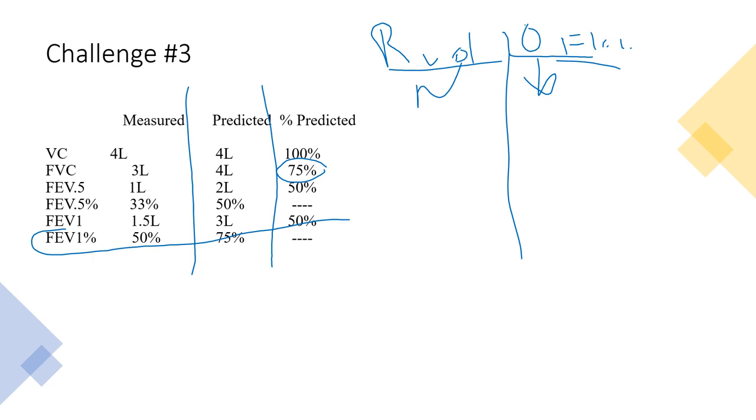And a normal volume. Oh, wait a second, Derek. What about my forced vital capacity? Wasn't that low, because normal is 80 to 120% of predicted? Yeah, that's low as well. However, just like we were talking about before, with patients that have obstructive airways disease, especially with premature closure of the airways, are they going to be able to exhale really fast and not have closure? No, they might have premature closure. So that's why we did the slow vital capacity. Right, we did a slow vital capacity here, and it showed that their volume is fine. It's just when they exhale really fast that their volume isn't fine. In other words, there's air trapping when they exhale fast. That's what we're seeing here.